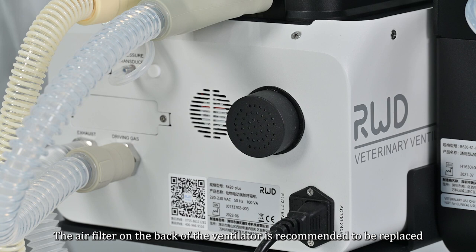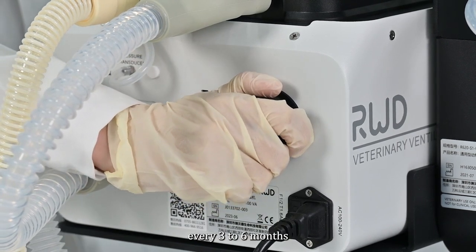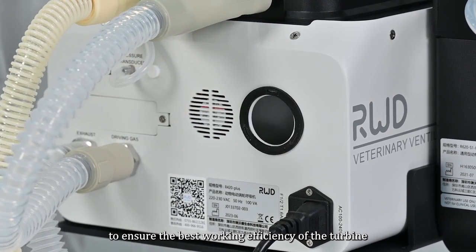For maintenance, the air filter on the back of the ventilator is recommended to be replaced every 3 to 6 months to ensure the best working efficiency of the turbine.